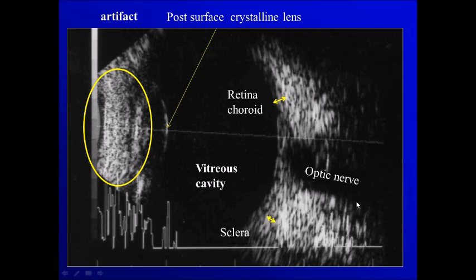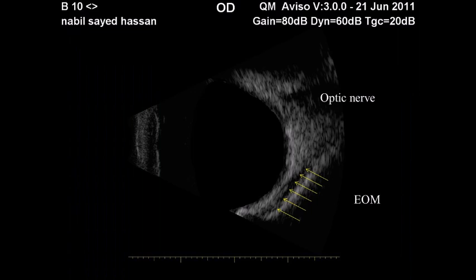Back here we have the optic nerve. There are not many interfaces for reflection, that's why it appears less reflective. While the surrounding area has higher reflectability from the loose connective tissue of the orbit, where we have connective tissue, blood vessels, lymphatics, etc.